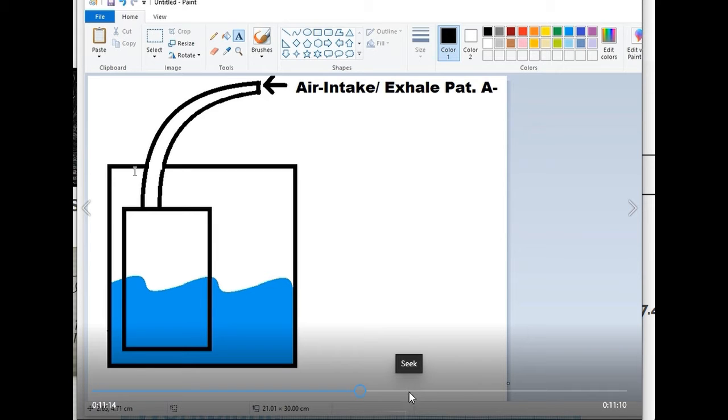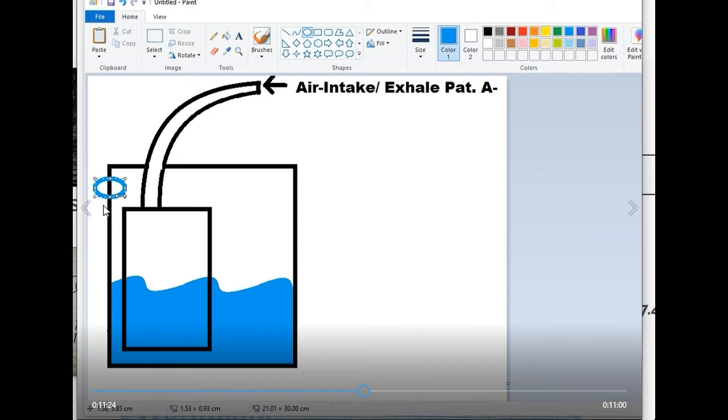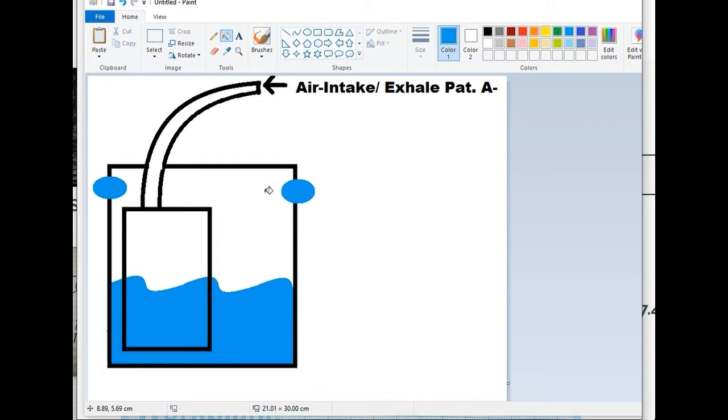Und jetzt, now I'm making the next thing. Actually, these are valves, das sind Ventile. So basically here you have fresh air from the interior, which means in another ventilation unit or respiration unit in a hospital, it depends.